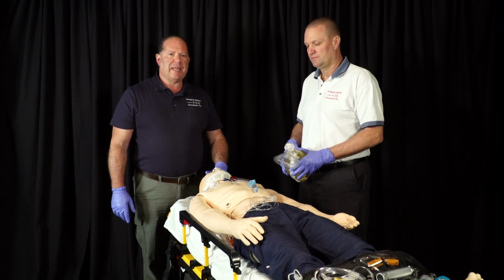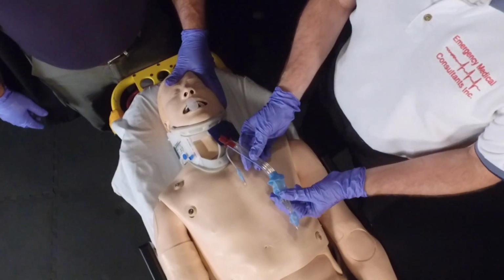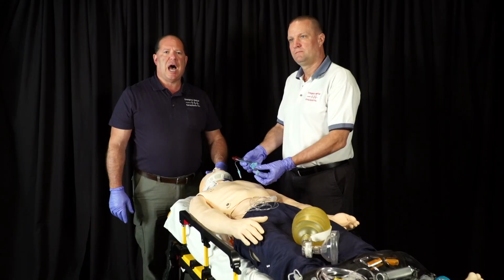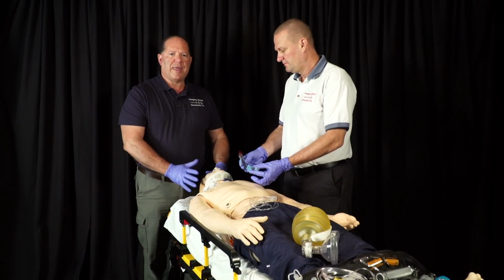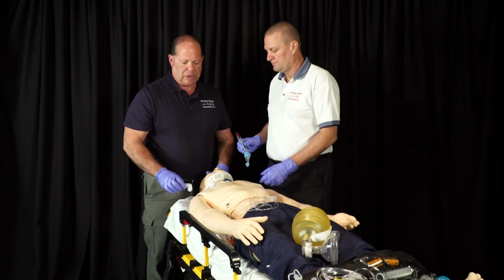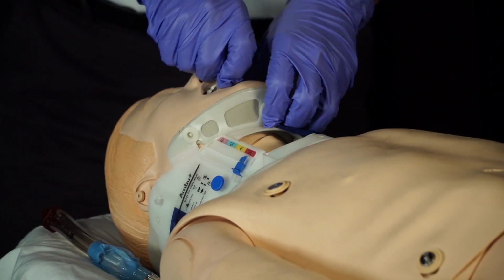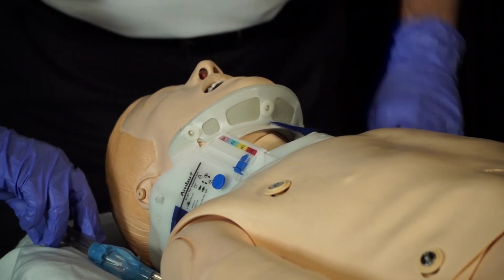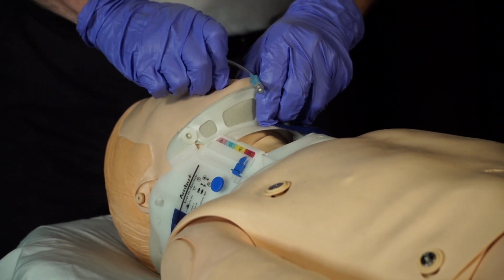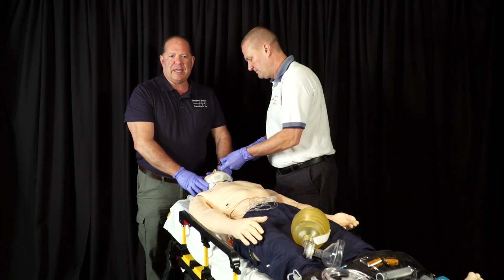The next device we'll look at is the King Airway. The King Airway is a double cuffed device that again is measured by the patient's height and placed in without having to move the patient's C-spine. And it's again another esophageal type device or paralaryngeal device. So the spine can remain neutral. The device is put in based on the patient's size and put into the esophagus. The tip of it sits in the esophagus. Again, quick and simple, inflated.